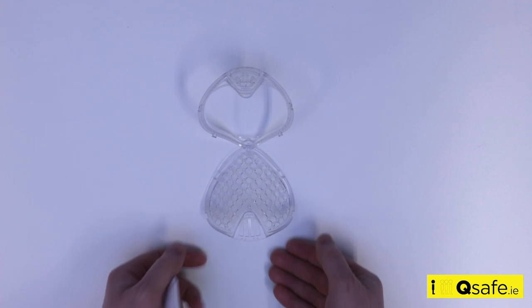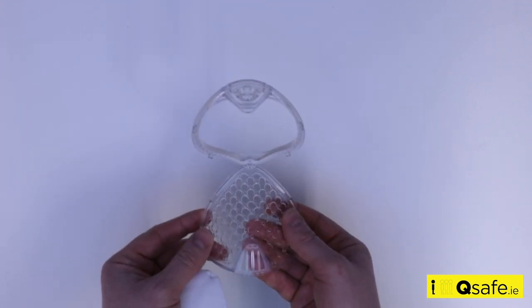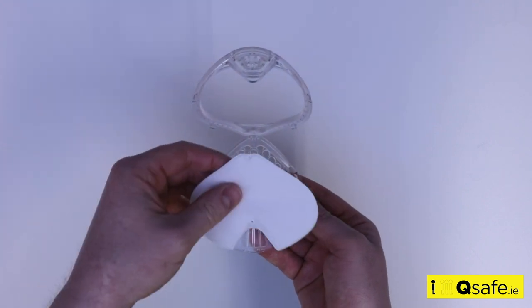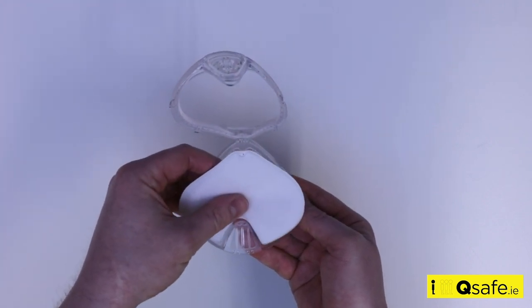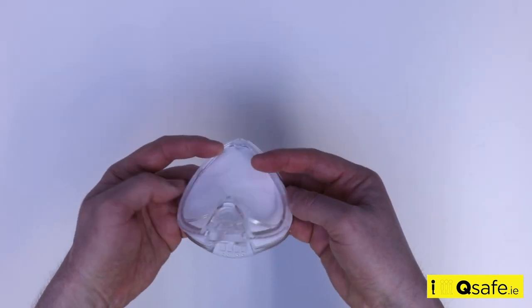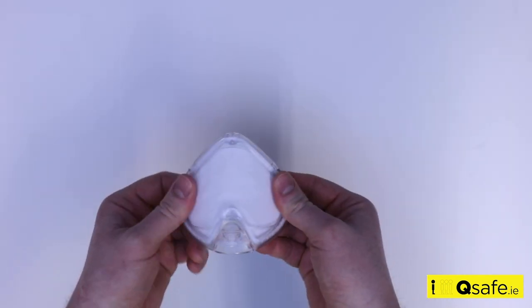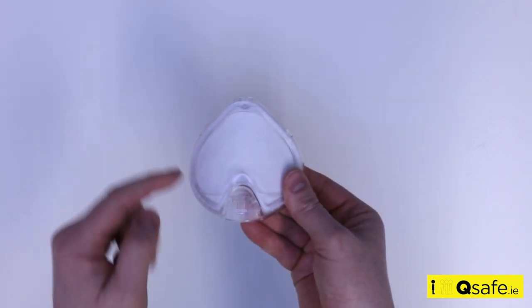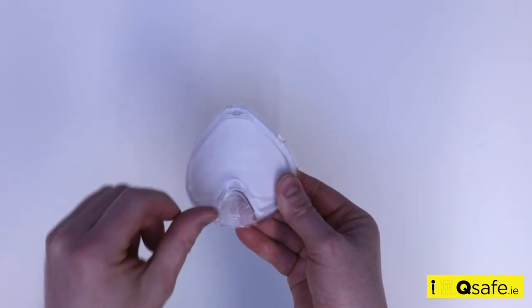Place the new filter into the filter housing, locating it securely in place using the two small location pins. Once the filter is in the correct position, gently close the filter housing, pinching it together and slide the locking tab back into the lock position.